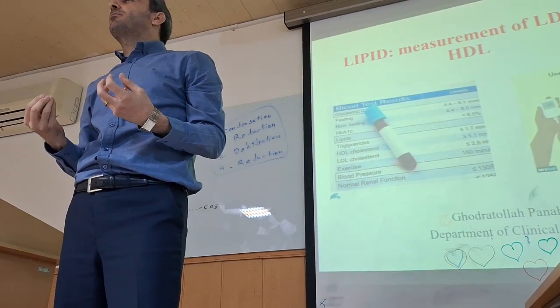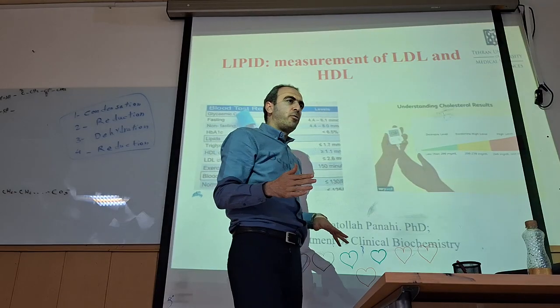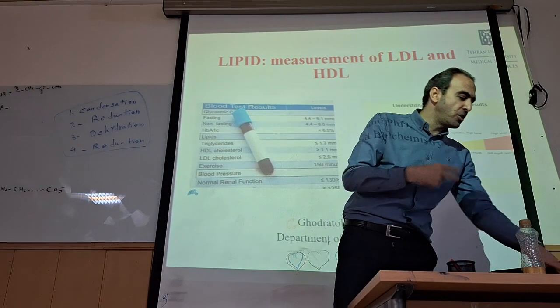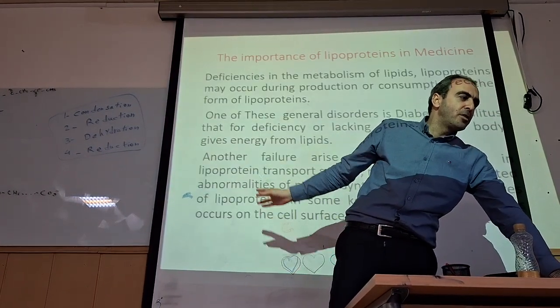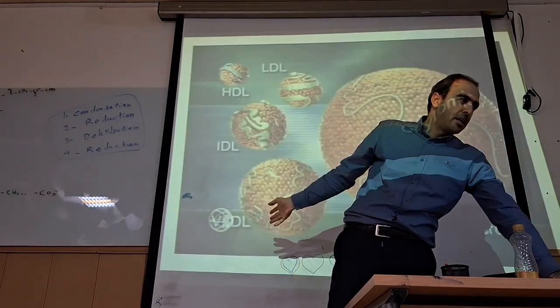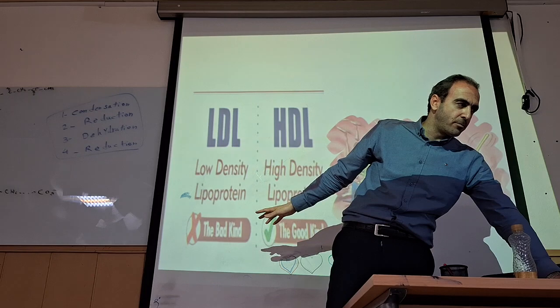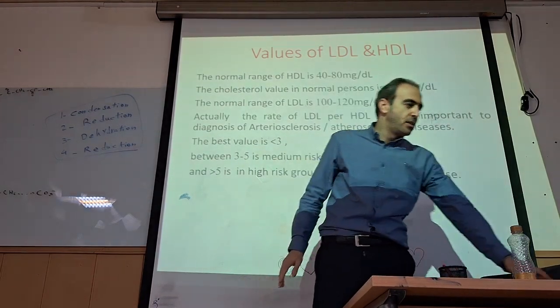...is measurement of. They are actually profiled in addition to triglyceride and total cholesterol. But today we just measure these two. You know the importance of the lipid measurement and the kind of lipoprotein, and because right now I explained them, we don't need all of them. Just how we are going to measure LDL.